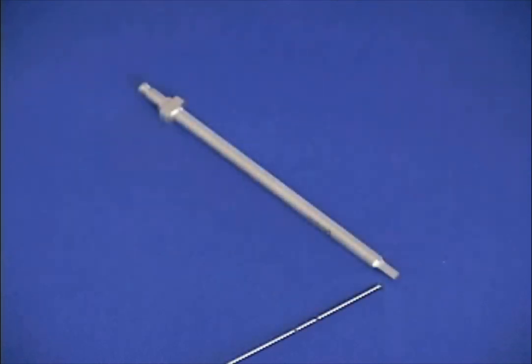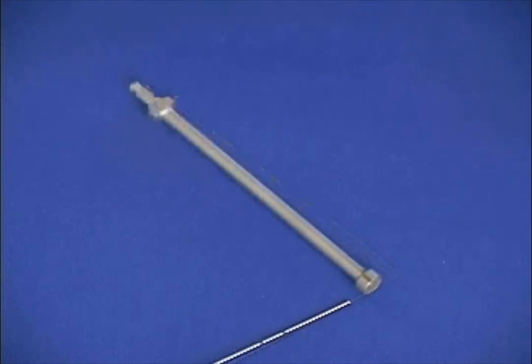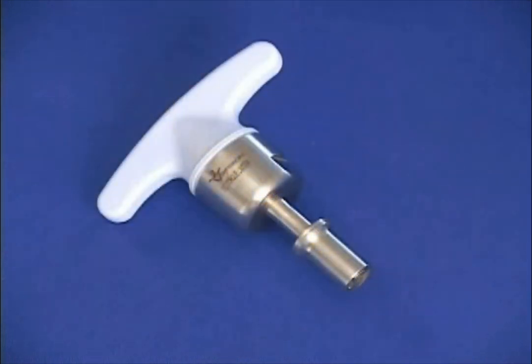The cross-connector cam wrench is utilized to lock the cams of the cross-connector. The cross-connector hex wrench is utilized to lock the hex nut of the cross-connector. The cross-connector torque limiter ensures that the correct final locking torque of 30 inch-pounds is achieved during final locking of the cams and center nut of the cross-connector.